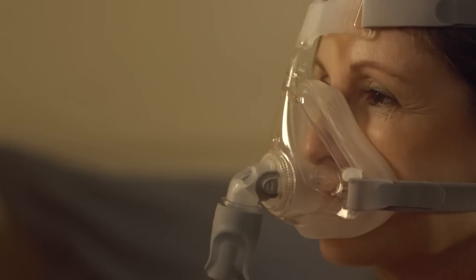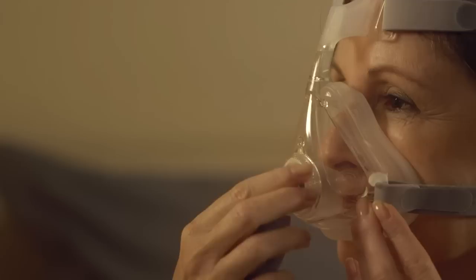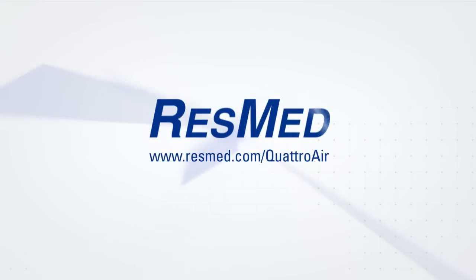Or it could be that the mask's elbow may not be fitted properly. Remove the elbow, then squeeze it back into place correctly. Refer to your user guide if in doubt. For more details and troubleshooting advice, go to resmed.com/QuattroAir.